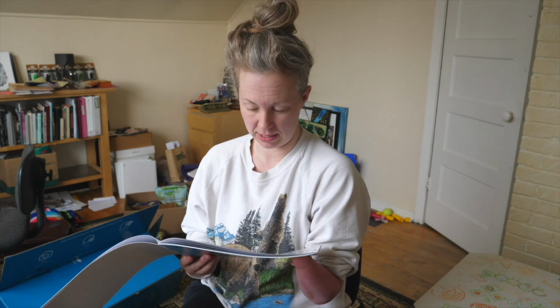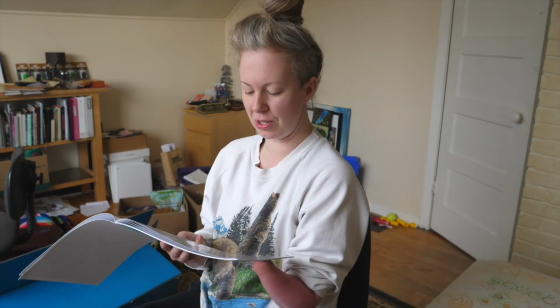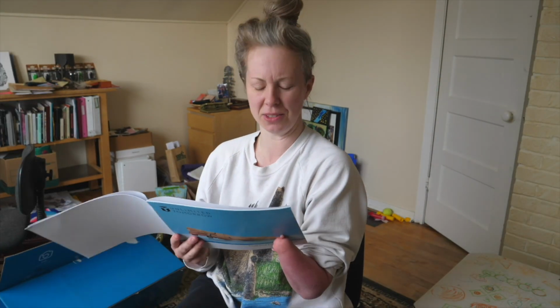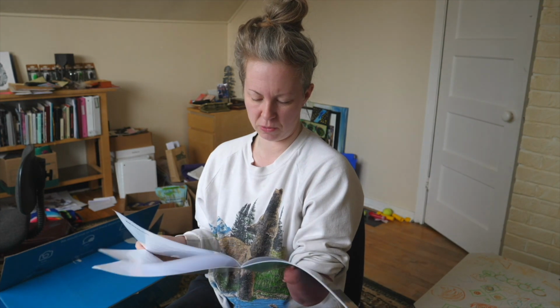Wash your stump. Okay. Dry it. Don't use oils or perfumes. That makes sense. Never wear a damp or a dirty socket or stump sock, as this may lead to irritation. Yeah, that sounds good. There's more about that, but I don't think I need to worry about it. That part's boring. Let's get into the calibration.